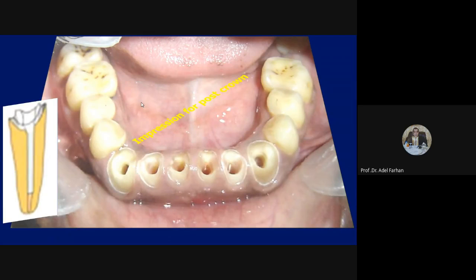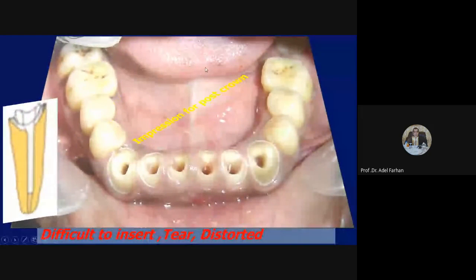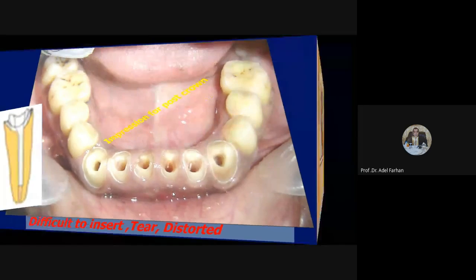حقيقه الامبريشن فور بوست كراون نحتاج بالامبريشن بوست كراون. بالبوست كراون المشكله عندنا امبريشن للكنال. اوكي الكنال هذه طبعا نحتاج شنو الماتيريال when you insert impression inside the canal and during removal of the impression ايش راح يصير؟ راح يصير tearing للامبريشن at the area of the core، لانه ماكو reinforcing للماتيريال. لذلك حتى نمنع التير والديستورشن during pouring شو نسوي؟ لازم you use reinforcement للماتيريال.